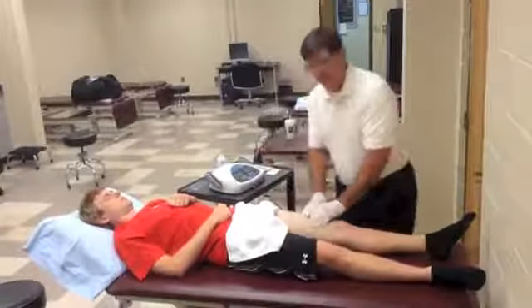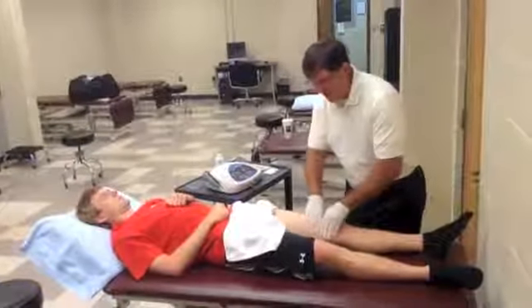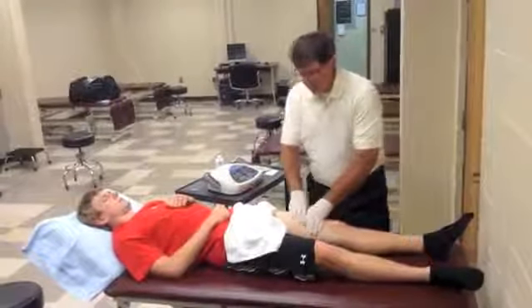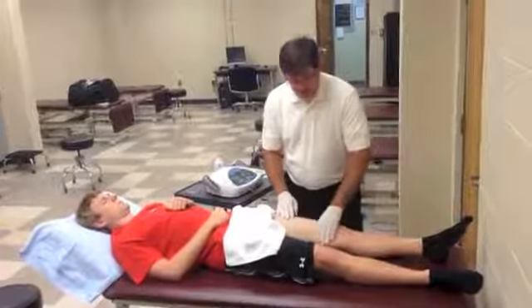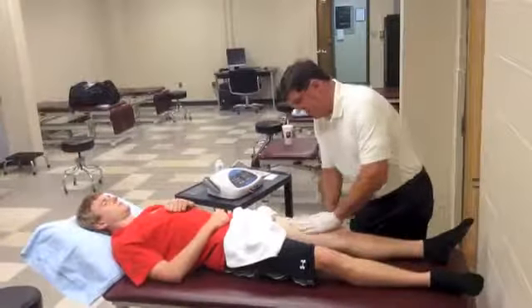Usually we'll deliver this treatment 10 to 15 minutes based on the patient's response, and it does have quite a blood pressure effect. I have noted personally that whenever I do 2 or 3 of these treatments in succession, I actually will experience some lowering of my own blood pressure. So it's a pretty dynamic treatment in that regard.